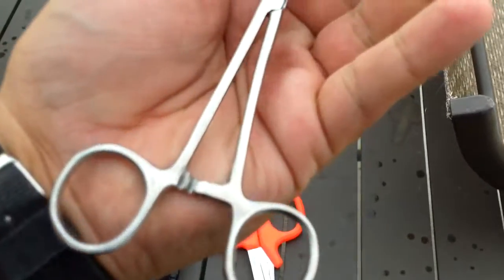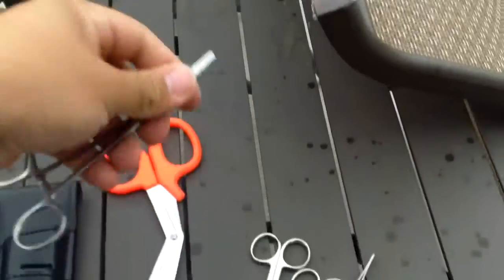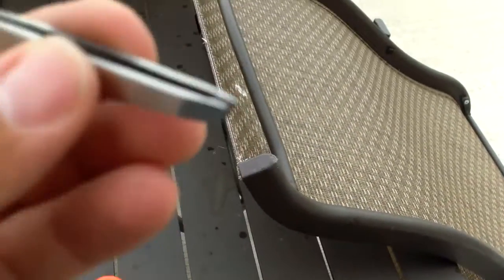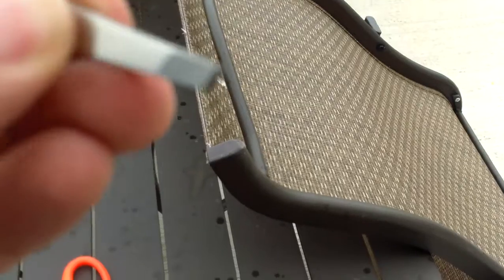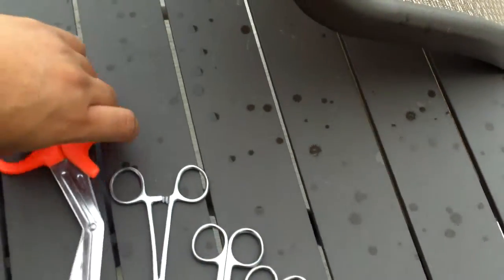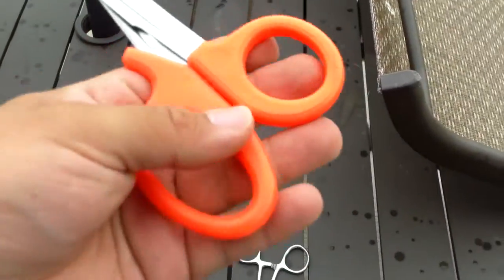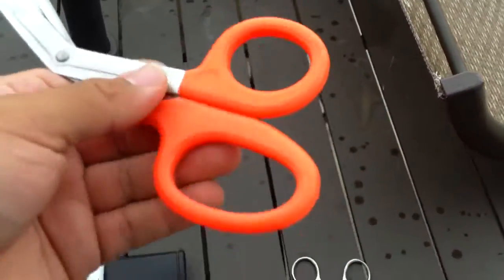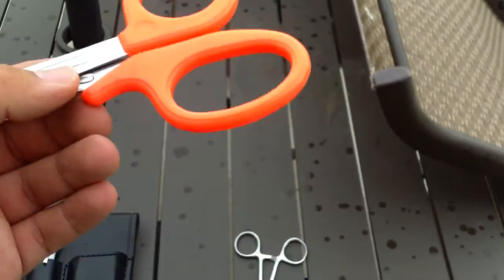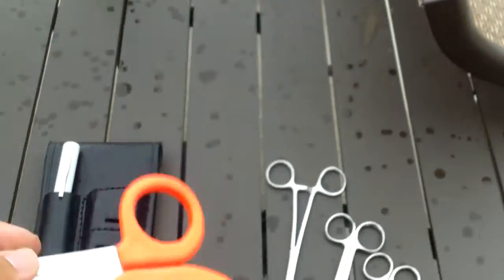The hemostats or forceps are just the Pakistan ones, along with the tweezers. The tweezers actually do have a nice edge to them and I feel like I can actually grasp things with them. The shears are just shears, nothing too special about them. They do have an orange handle, so they're easier to see at night if you drop them, and if they get covered in fluids, it's easier to spot them when you need to clean them.